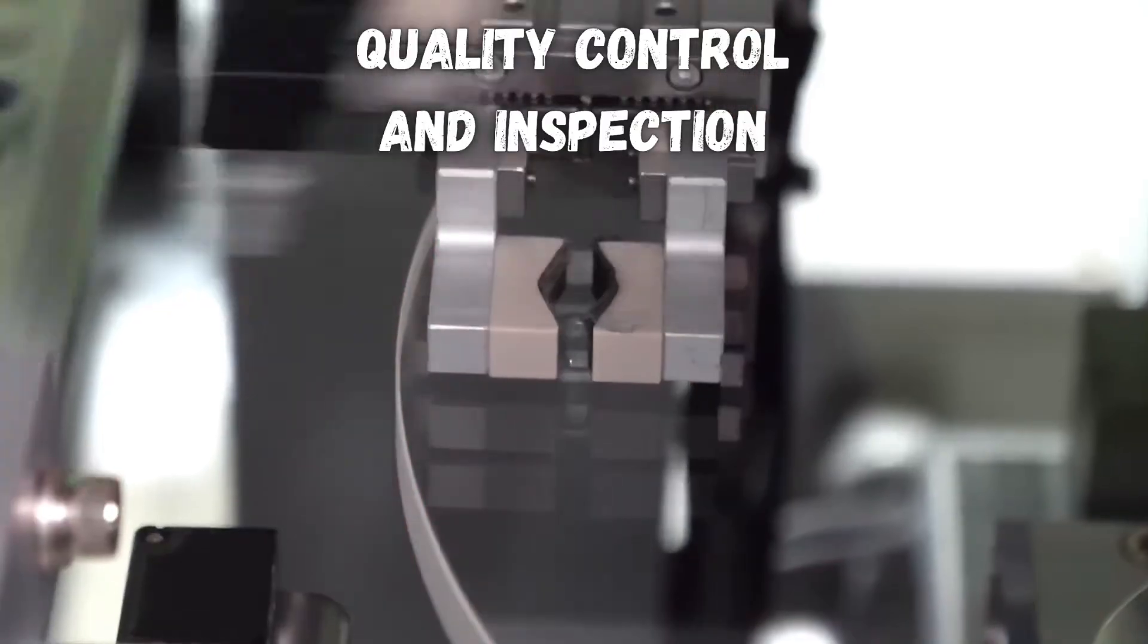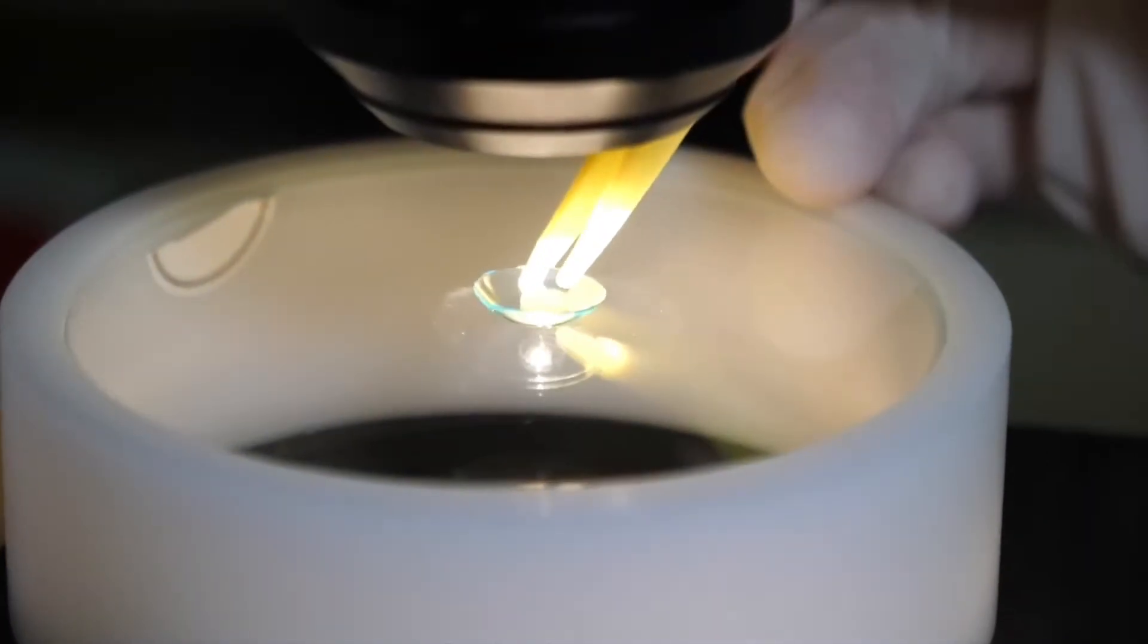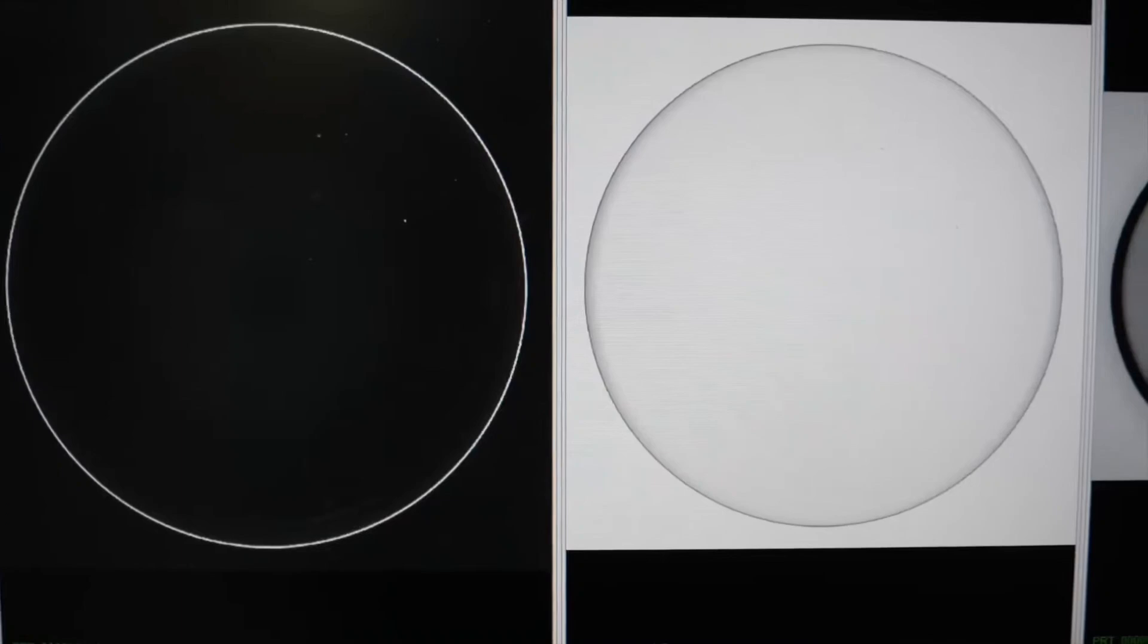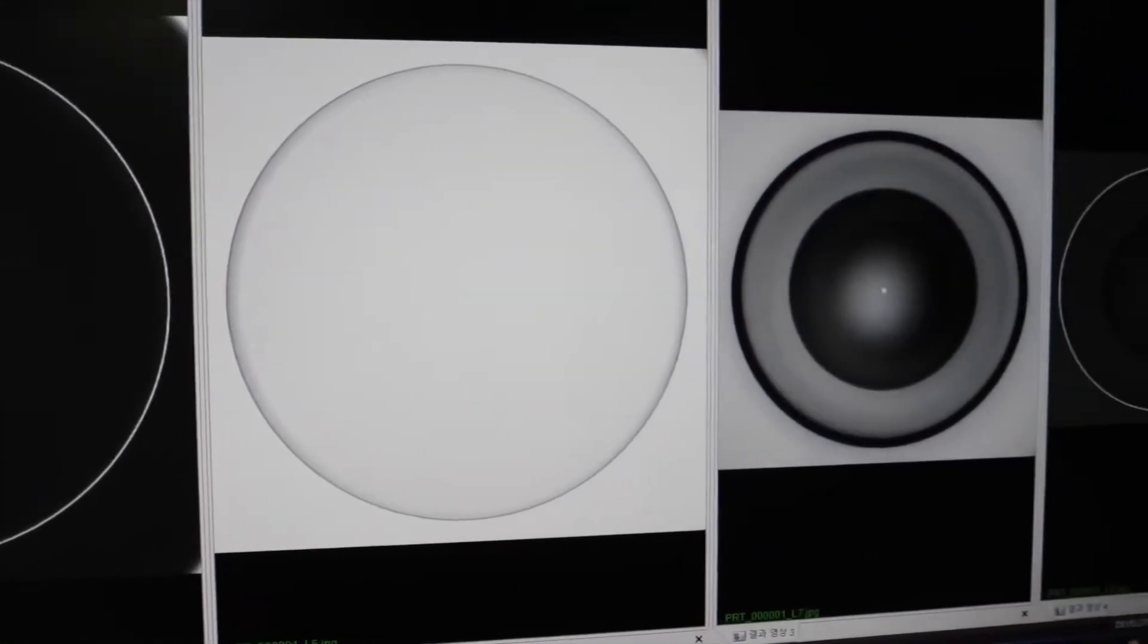The contacts then go through quality control, where microscopes are used to check for imperfections, like bubbles, tears, or uneven surfaces.